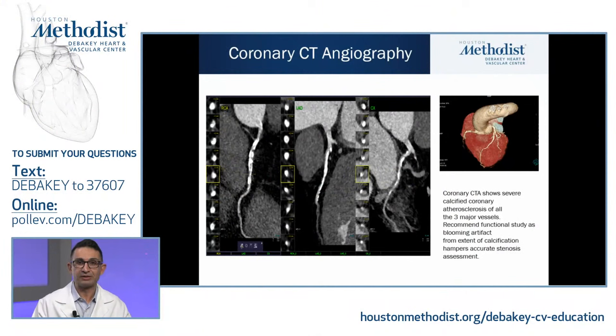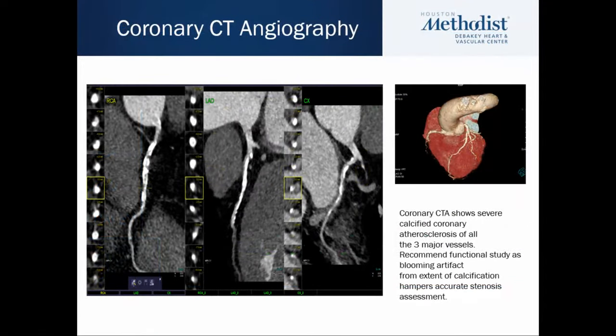The patient underwent anatomical testing with a coronary CT angiography. And the coronary CT angiography, as Dr. Amala clearly mentioned, showed extensive coronary artery calcification in all major epicardial arteries. His coronary calcium, as we get to it later, was more than 2,000.